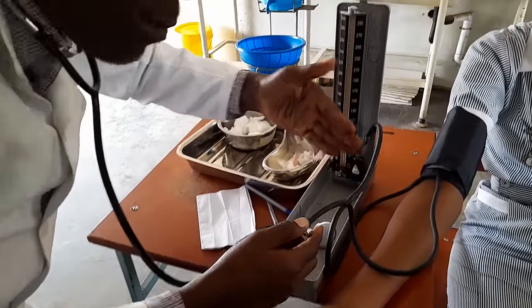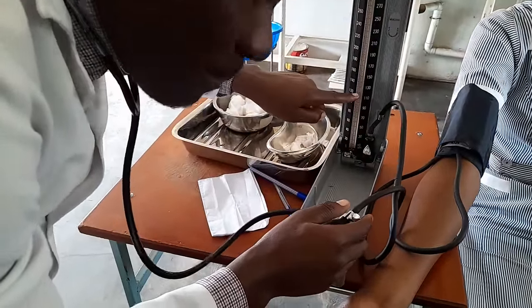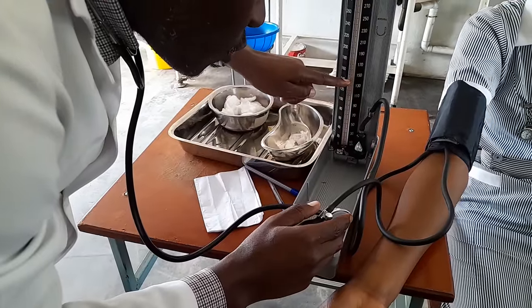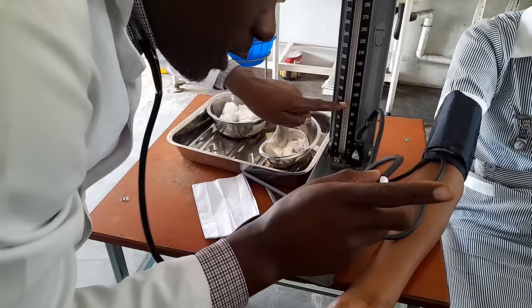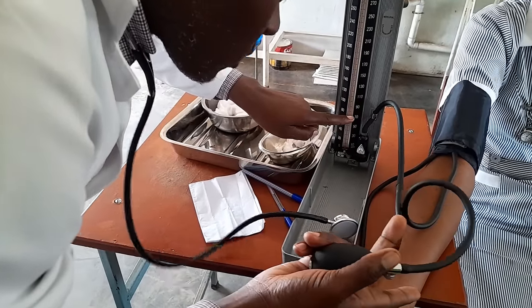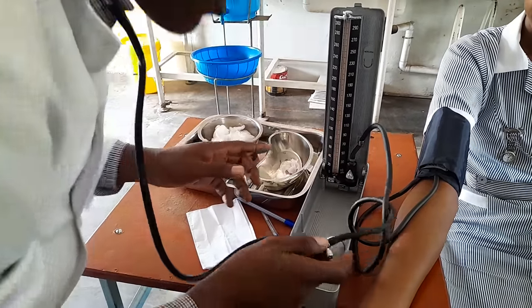Just to be sure, you can pump again — go to about 140, since you heard the beat at 110 that was the systolic. Try to confirm: if you feel the first beat at 110, that is the systolic. Then the last beat before they diminish — at 70 — becomes your diastolic. So your blood pressure is 110 over 70. That's what you're going to record.